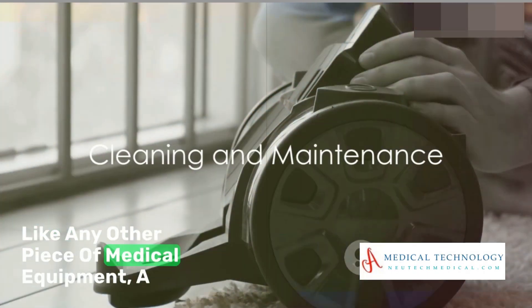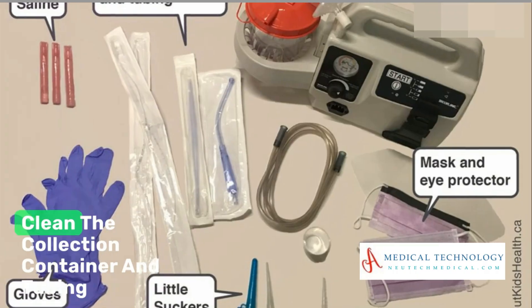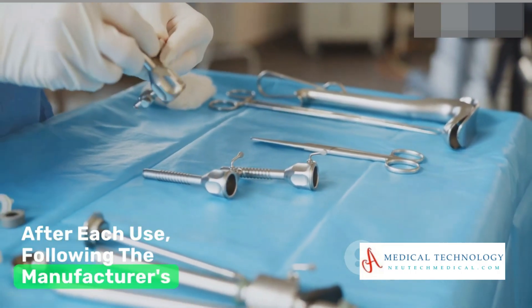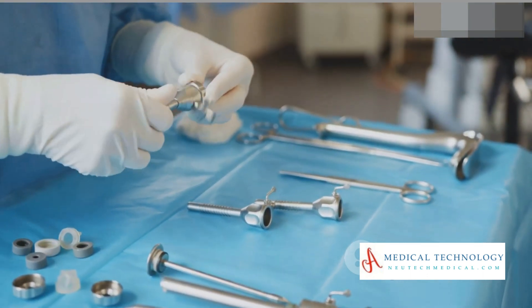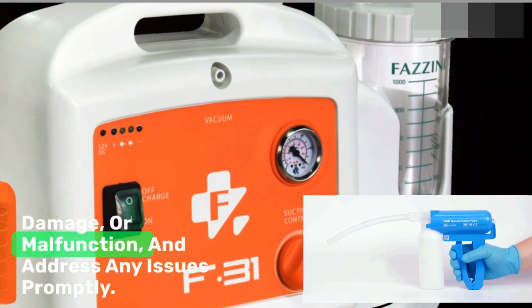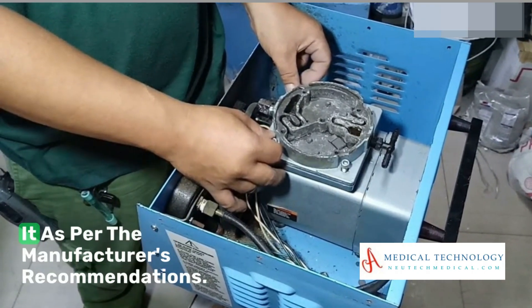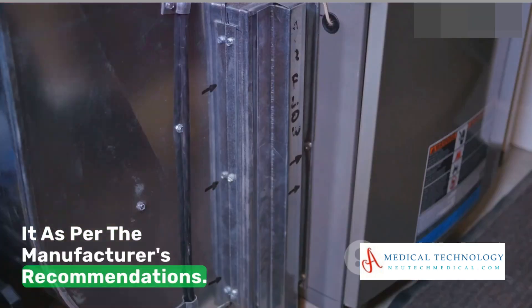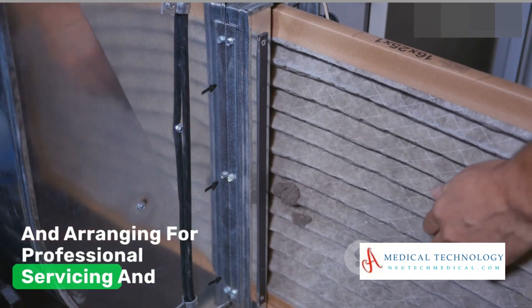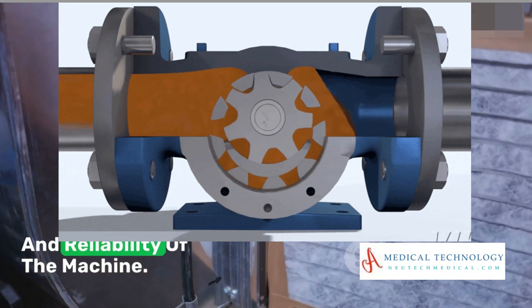Like any other piece of medical equipment, a suction machine requires regular cleaning and maintenance. Clean the collection container and tubing after each use, following the manufacturer's guidelines for cleaning and disinfection. Inspect the machine regularly for signs of wear, damage, or malfunction and address any issues promptly. If the machine has a filter, replace it as per the manufacturer's recommendations. Adhering to the recommended maintenance schedule and arranging for professional servicing and calibration as needed ensures the longevity and reliability of the machine.